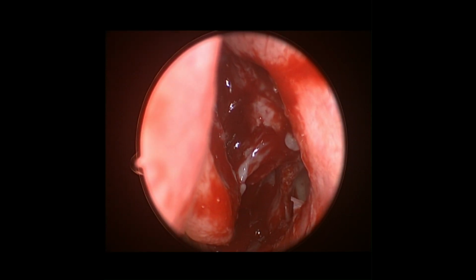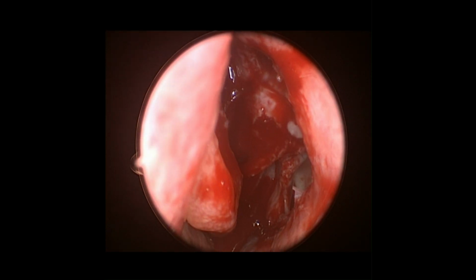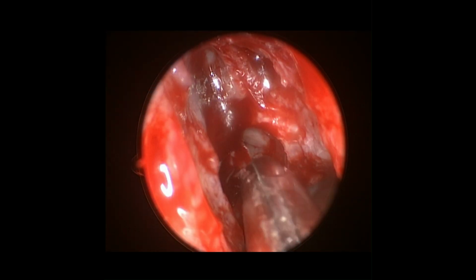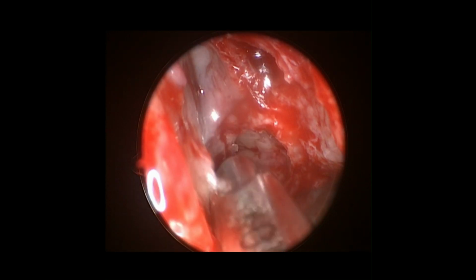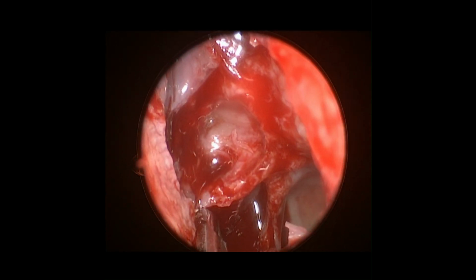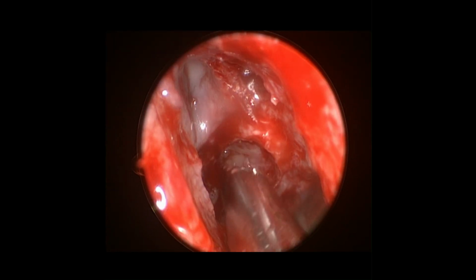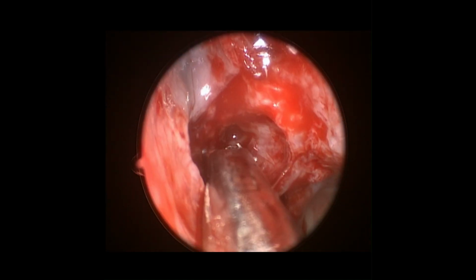Actually, the retrobullar and suprabullar recess combined are called the lateral sinus of Grunwald or hiatus semilunaris superioris. The main aims of FESS are, number 1, restoration of ventilation and drainage directed to all affected sinuses, and number 2, preservation of normal mucosa as much as possible.